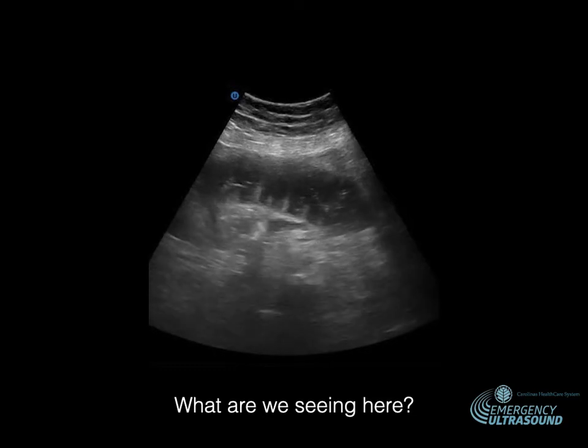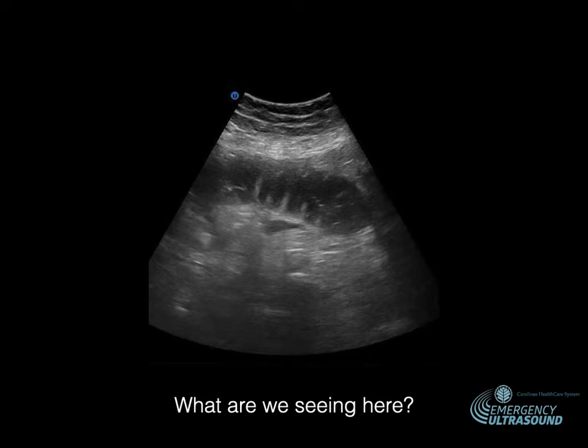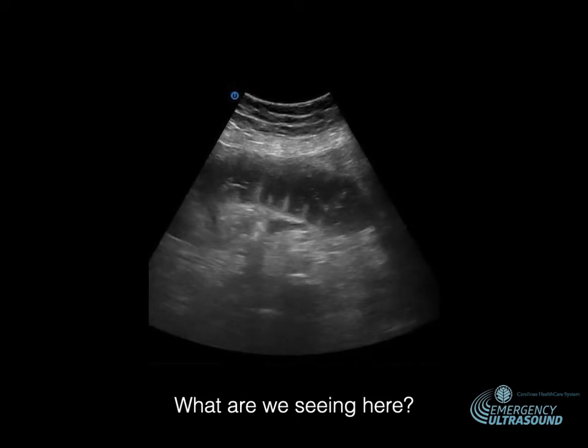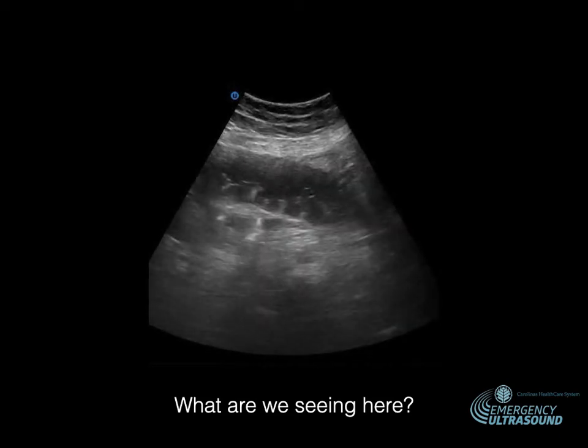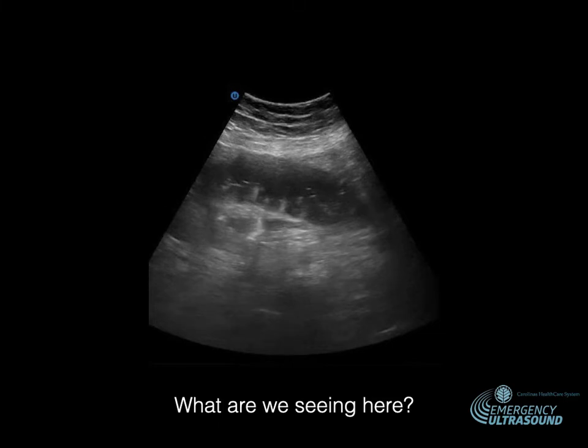So now what are we seeing right here? If you look closely, this is just going to play for a minute. I don't have any measurements on this. I don't have any clips. It looks like it could very well be dilated, but we are looking in the middle of that bowel lumen.